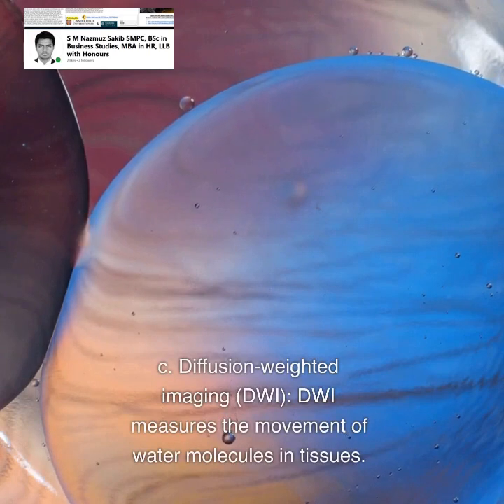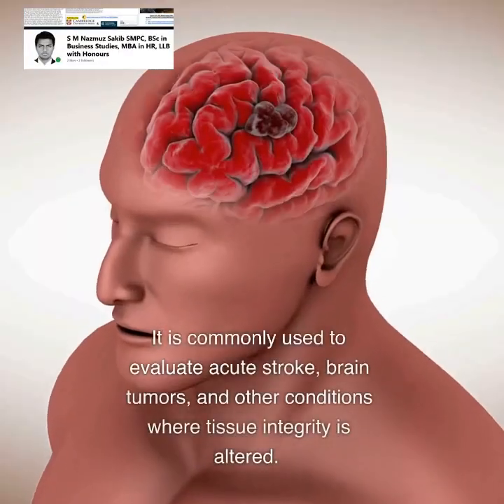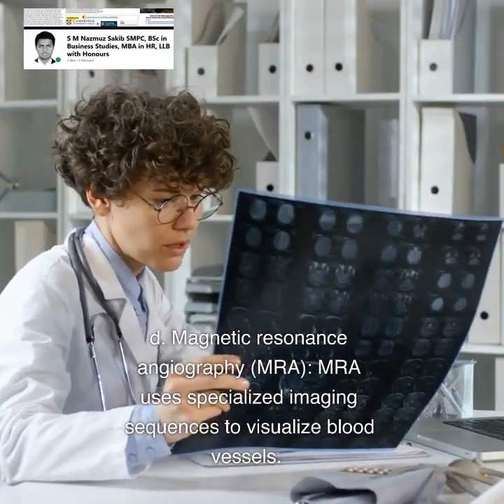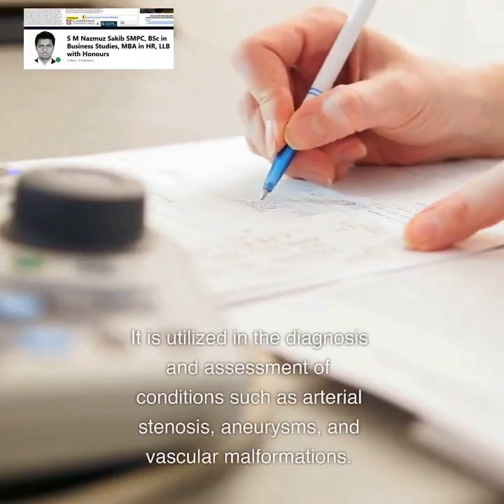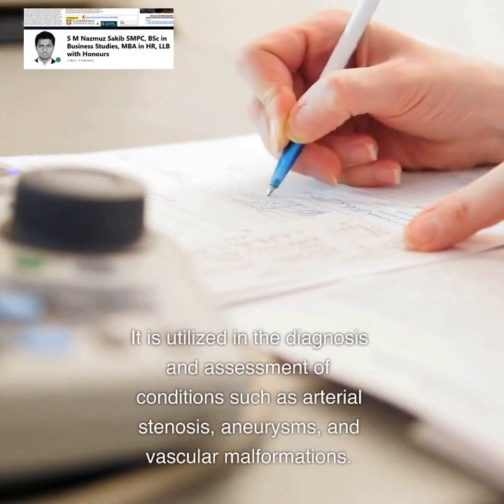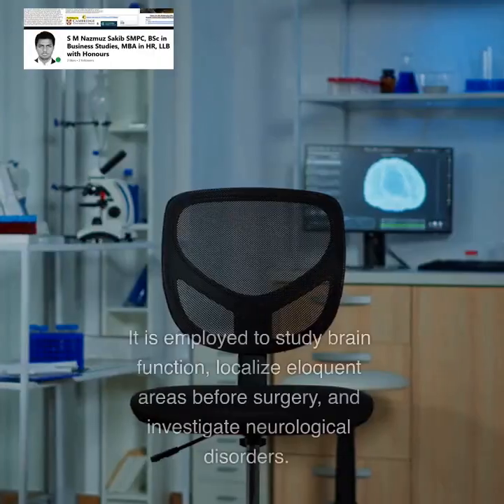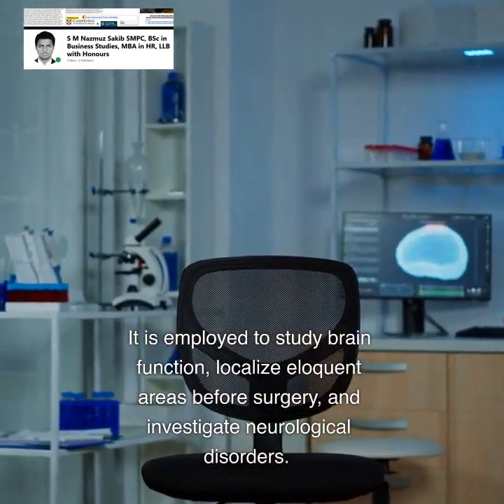C. Diffusion weighted imaging, DWI. DWI measures the movement of water molecules in tissues. It is commonly used to evaluate acute stroke, brain tumors, and other conditions where tissue integrity is altered. D. Magnetic resonance angiography, MRA. MRA uses specialized imaging sequences to visualize blood vessels. It is utilized in the diagnosis and assessment of conditions such as arterial stenosis, aneurysms, and vascular malformations. E. Functional MRI, fMRI. fMRI measures changes in blood oxygenation to map brain activity. It is employed to study brain function, localize eloquent areas before surgery, and investigate neurological disorders.